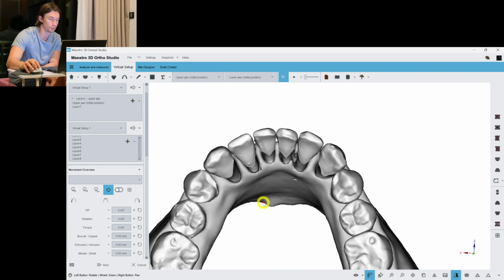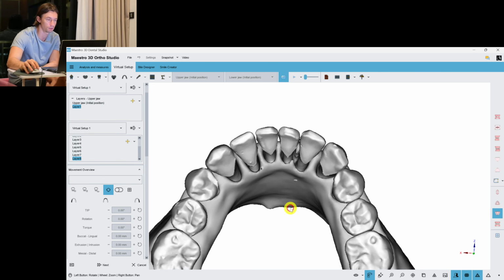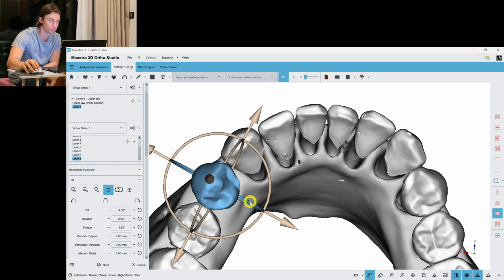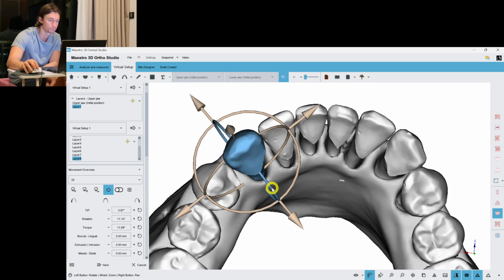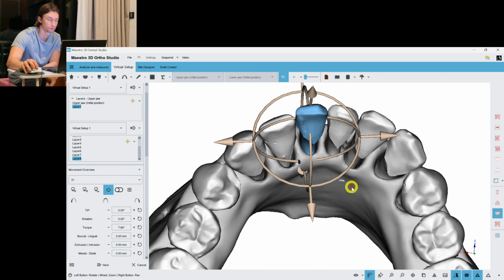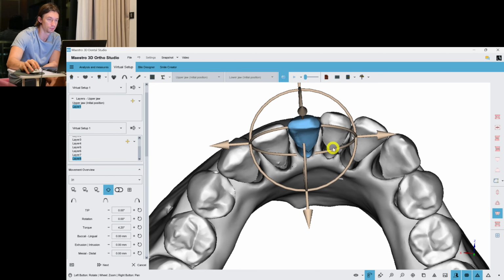And layer 8 is going to be our final layer, where we close all the spaces by tipping the frontal teeth to the lingual direction.